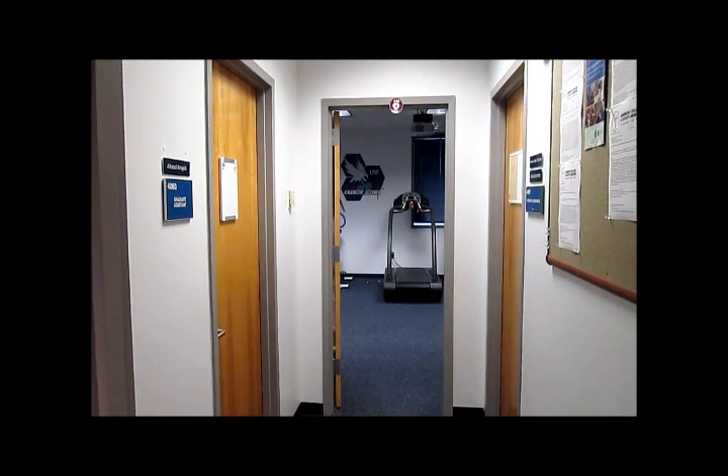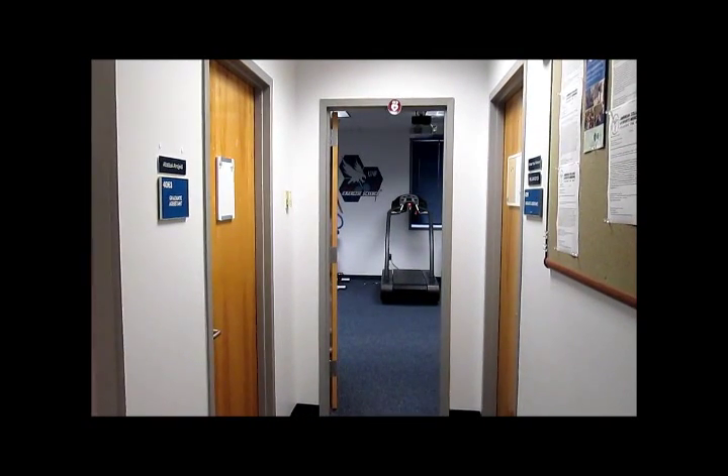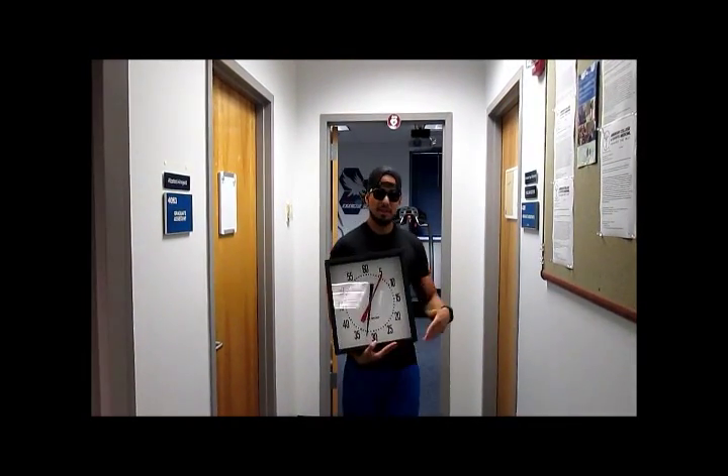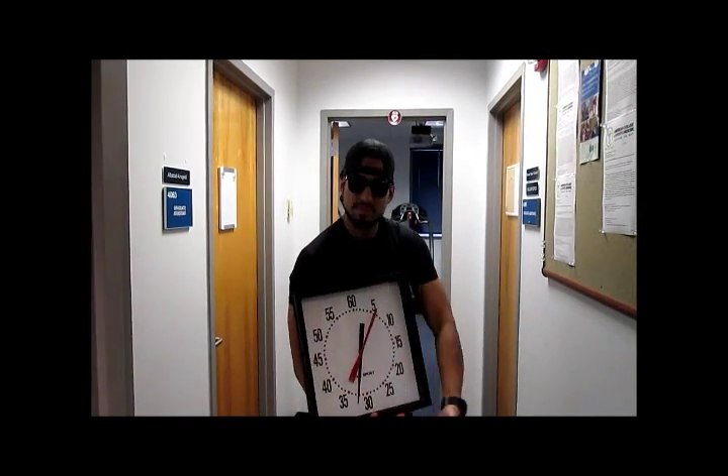Next thing we will be needing is a clock to keep time during the test. The clock is used in the stages to know how long the participant is to stay at each stage.